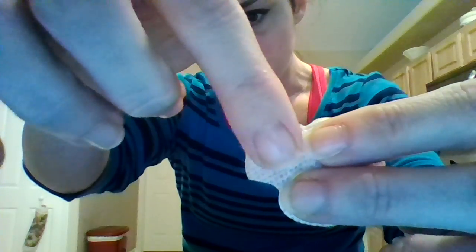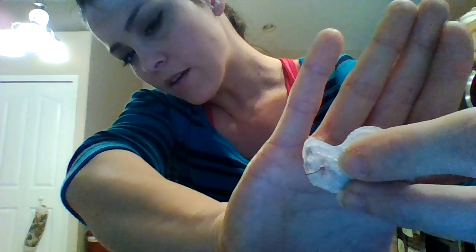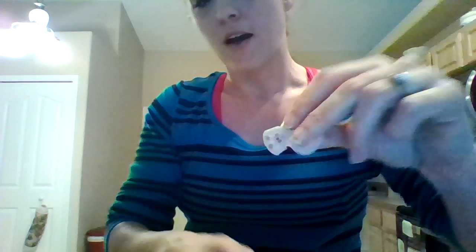This little thing is an electrode, and it's actually just a very flimsy looking wire, almost, I guess, for lack of a better word. I'm not sure if you can see it. There you go. It's kind of flattish, but it's super flimsy, no pain, nothing like that. A little bit longer than the cannula that goes in, but it's actually much softer than the cannula that goes in for your infusion site. Okay, so anyway, now it's time for a new one.